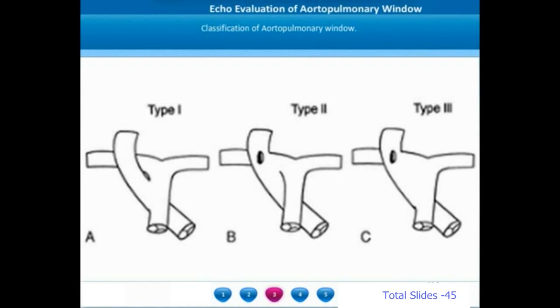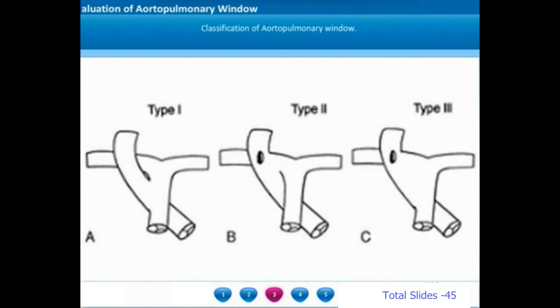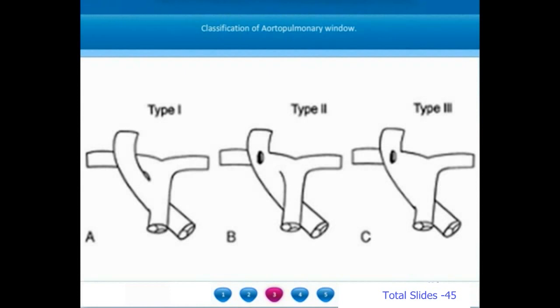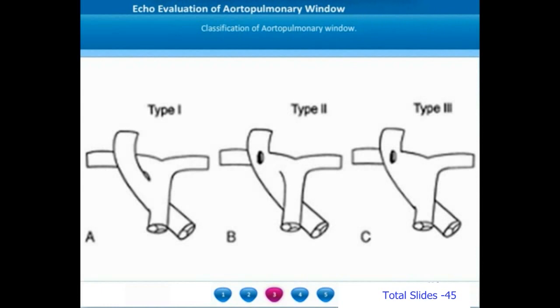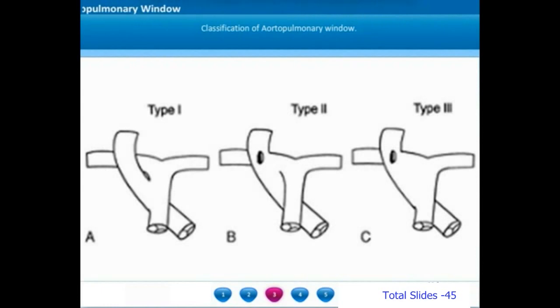Proximal defects are defects which are very close to the semilunar valves — close to the aortic and pulmonary valves — and there is a well-defined distal border in a proximal defect. Distal defects are more distally located, and the distal extent of these type 2 defects almost extends to the pulmonary bifurcation.